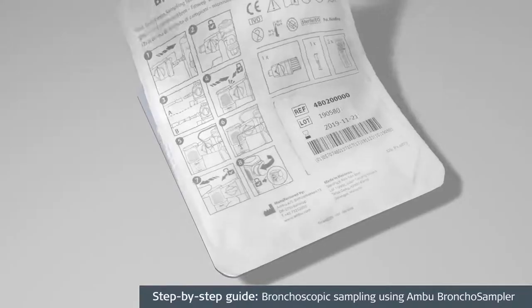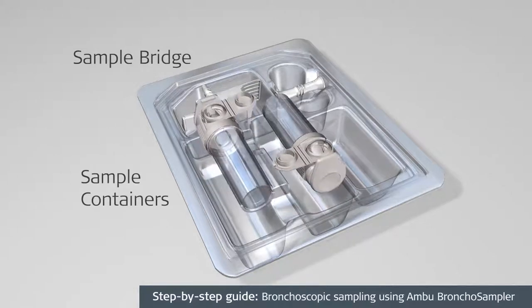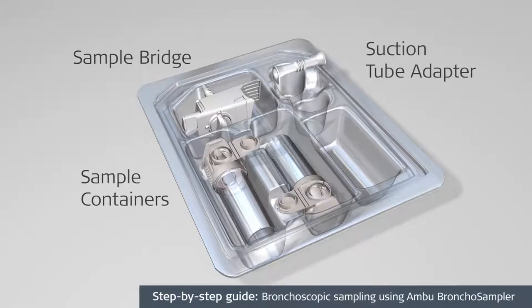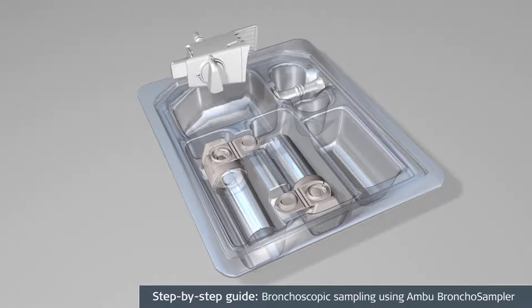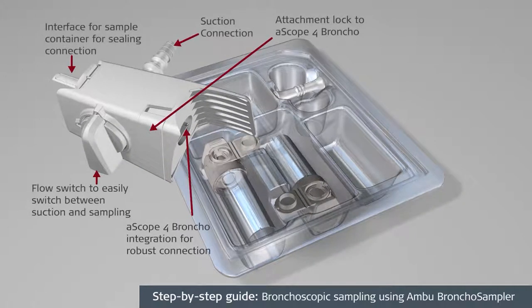The Bronco Sampler comes packaged sterile in a tray containing the sampler bridge, two sample containers, and a suction tube adapter. The sampler bridge connects the sample container to the A-Scope IV Bronco and houses the flow switch, which allows an operator to easily switch between sample collection and suctioning.